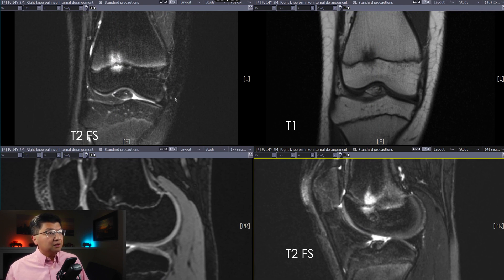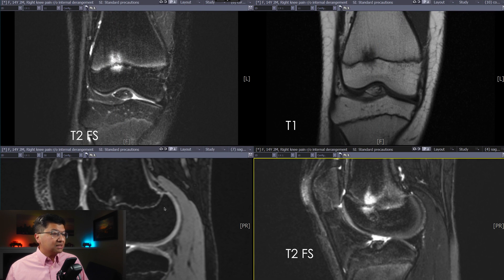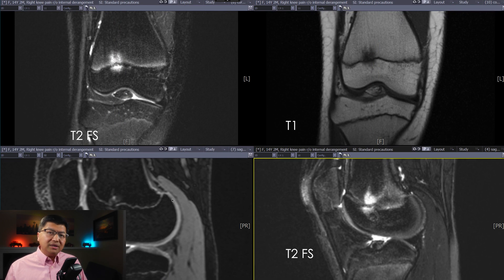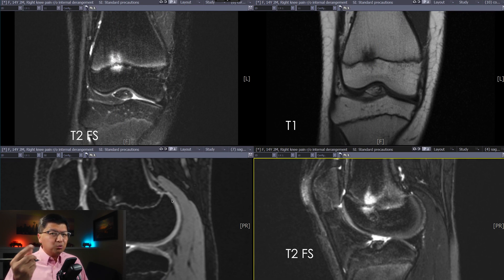That drives home the message of what we're looking at. Here we have a T1-weighted sequence. Here we have a dual-echo-steady state, or DESS sequence, which is a T2-weighted sequence that's gradient and acquired in very thin slices, typically 0.6, 0.7 millimeters.